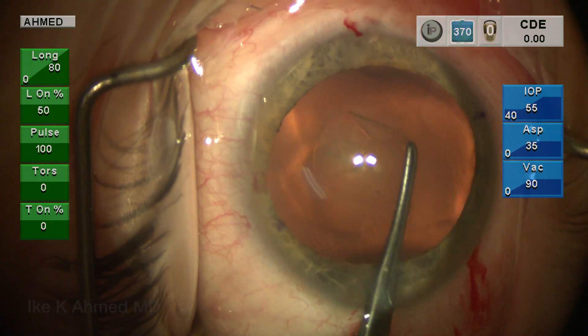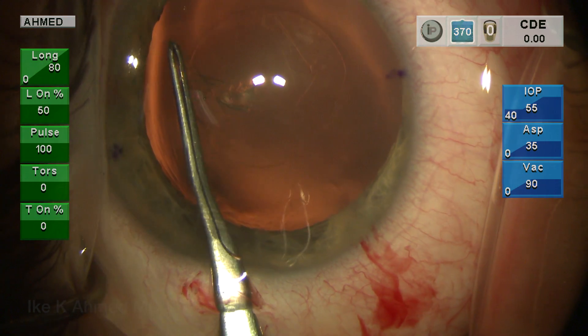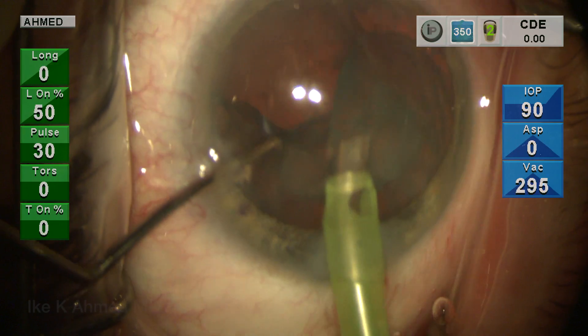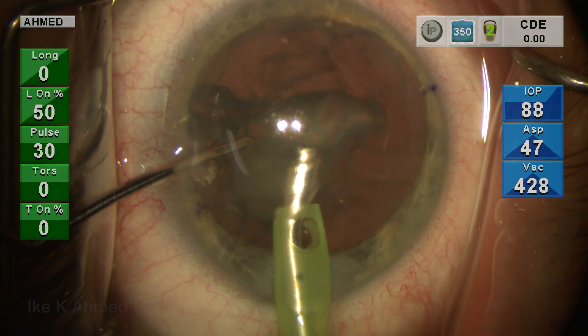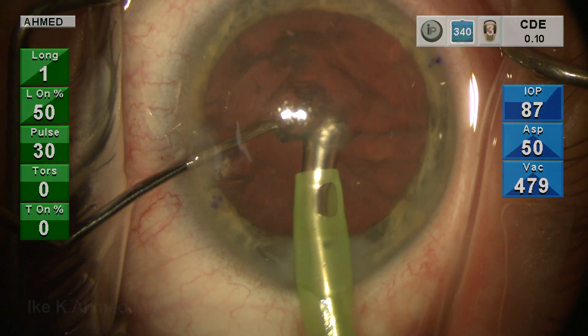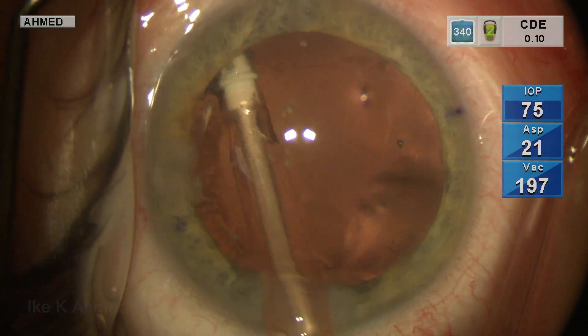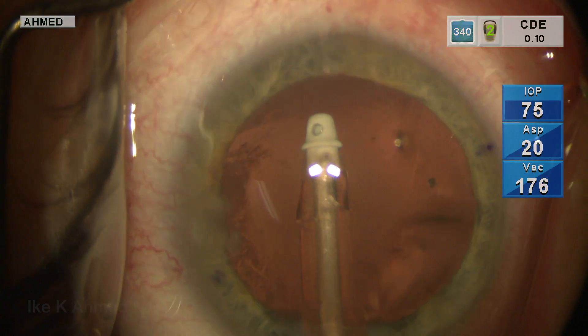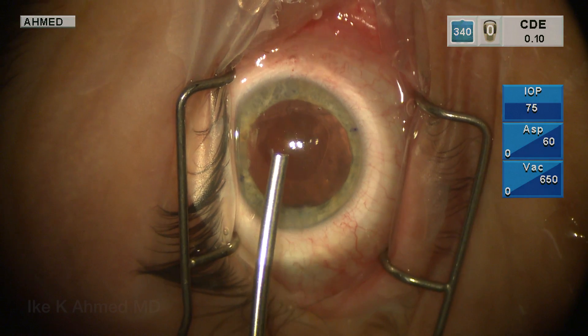Our goal here was first to remove the cataract, examining for any potential zonular weakness with a history of trauma. Her zonules appear to be fairly stable after the capsulorhexis was performed uneventfully. Phacoemulsification and IA of cortex is performed uneventfully, and we'll proceed in this case to place a capsule retention ring here just for security purposes and to ensure adequate centration, especially since we're considering the use of a multifocal lens.